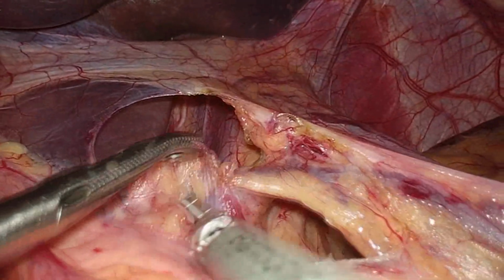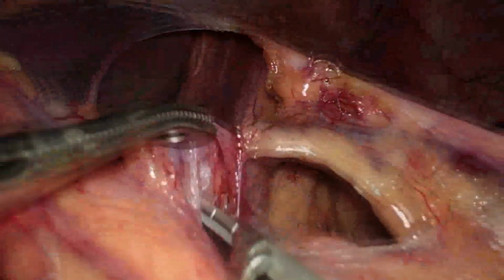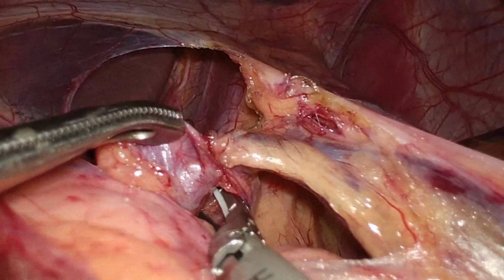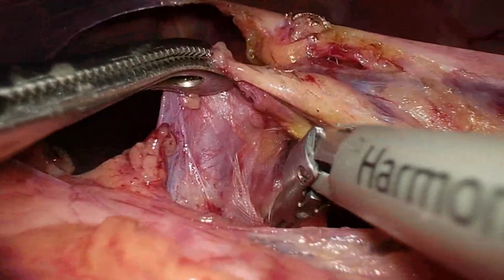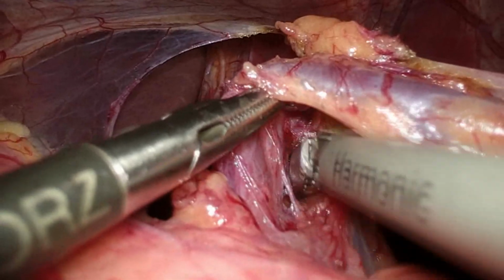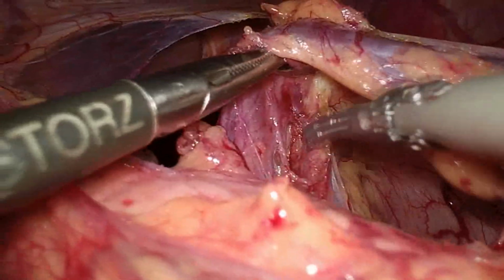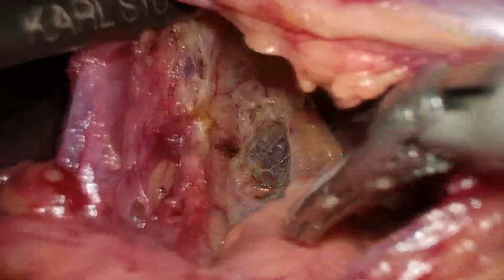The surgical therapy involves either removal of the nerve plexus around the celiac trunk and dissection of the celiac artery completely, that is called celiac ganglionectomy, celiac artery decompression, or reconstruction and stenting if it is too narrowed. So these are the multiple options available for therapy for median arcuate ligament syndrome. In this patient, we did celiac artery decompression, and we excised the neural tissue along the celiac trunk.